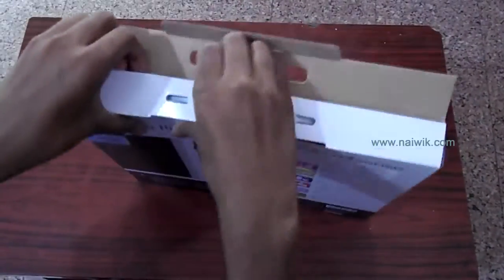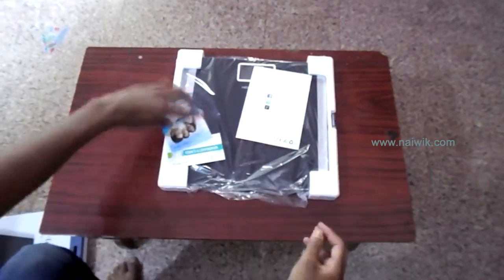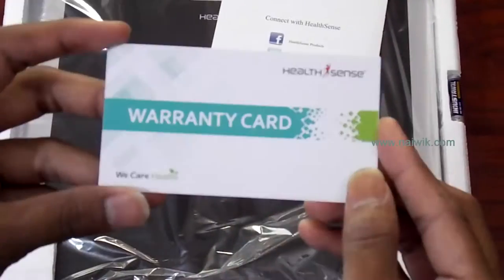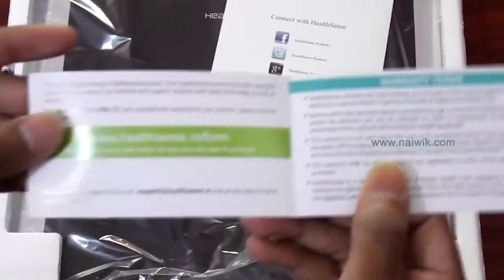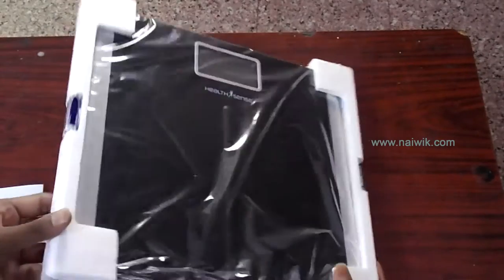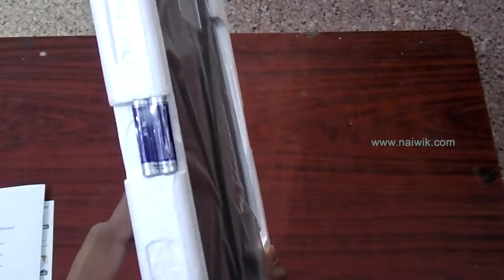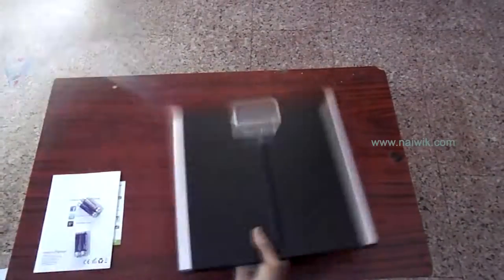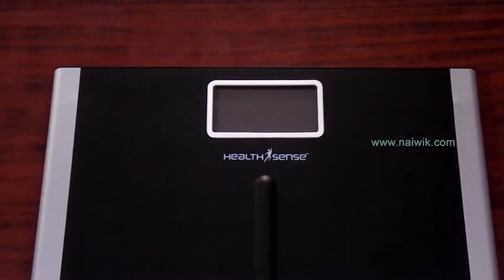Now let's remove the main unit. Here is the weighing scale, and it comes with three booklets — a warranty card, a user manual on how to use the HealthSense product, and it also comes with four triple-A batteries.